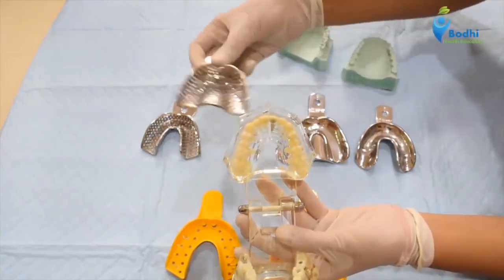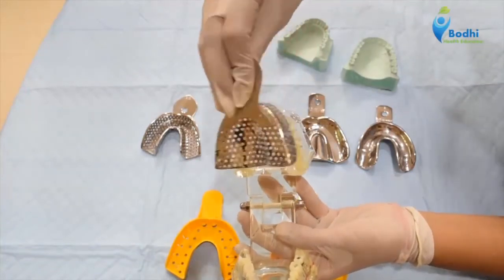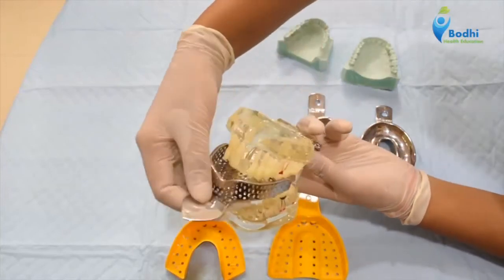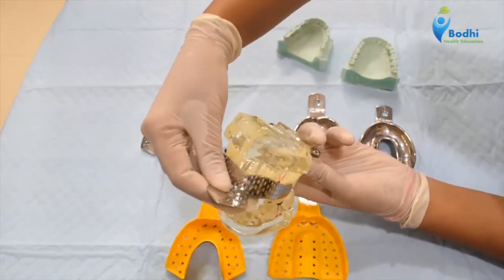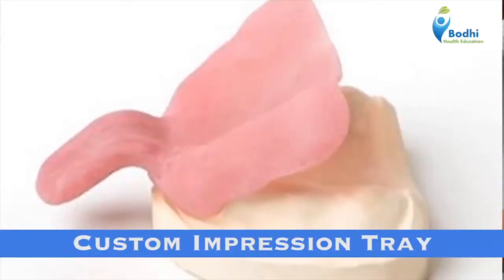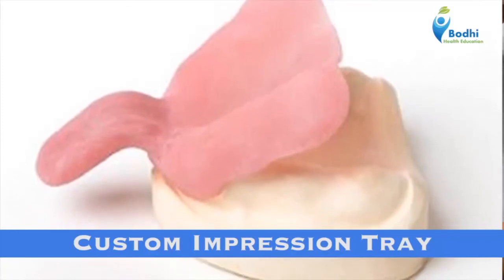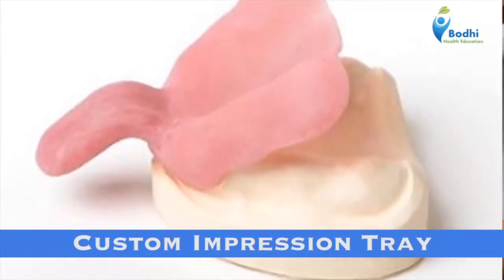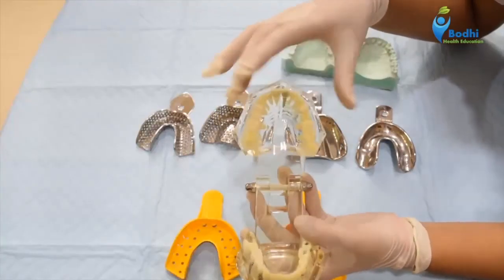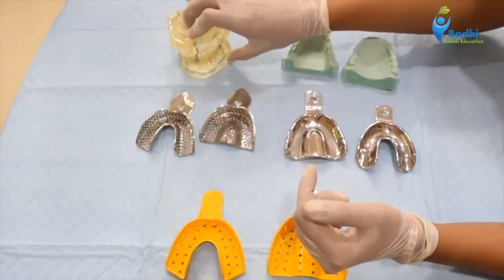So for the maxillary impression tray selection, the size can be checked by keeping it in the patient's mouth like this. We can check for the clearance and the size of the tray. There are custom made or special impression trays also, which we can fabricate in the clinic depending upon the size of the patient's jaw. They would be snugly fitting according to the patient's jaw size.